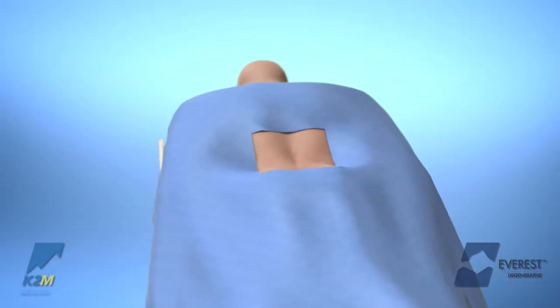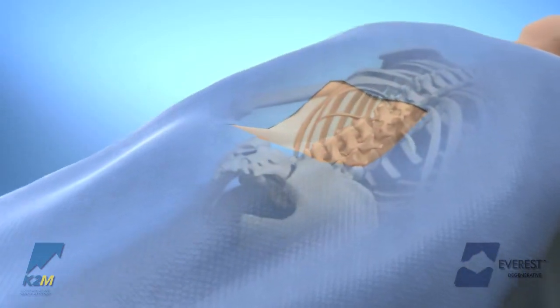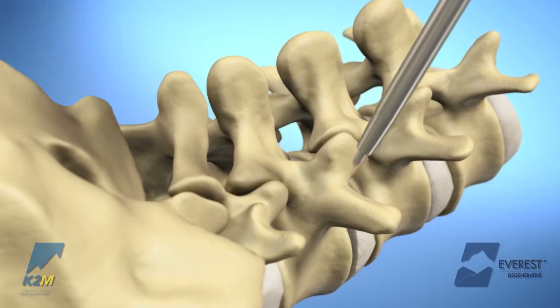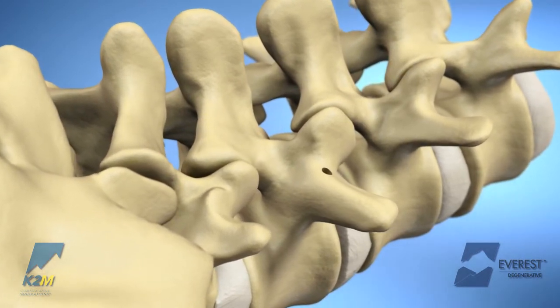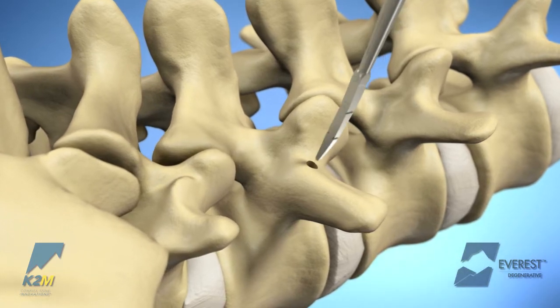The patient should be positioned as appropriate for a posterior approach, taking care to preserve or improve sagittal alignment of the spine. The small cortical crest of the pedicle is perforated with an awl, or is removed with an available rongeur or burr to expose the underlying cancellous bone.